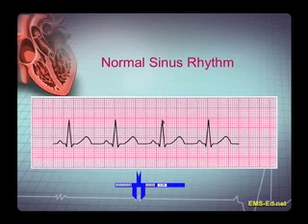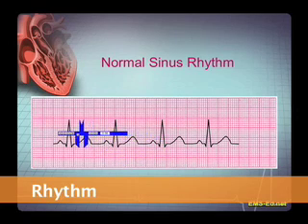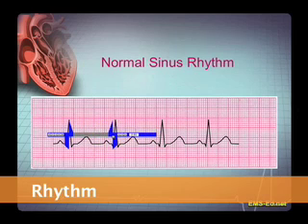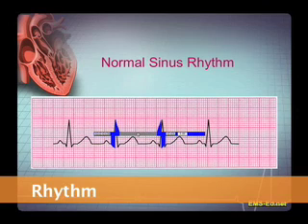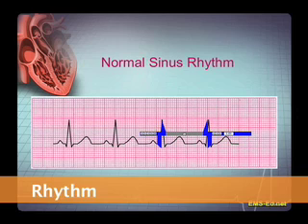Now let's look at the rhythm. Is it regular, and how would we know? We measure the distance between R waves again. It's about four and a half big boxes between R waves. So let's take our calipers and try to be a little bit more accurate. We measure from successive R wave to successive R wave — and successive R waves seem to be about the same. Therefore, the rhythm is constant.